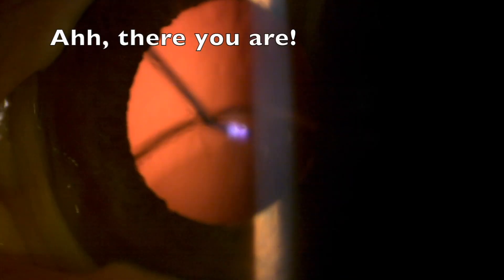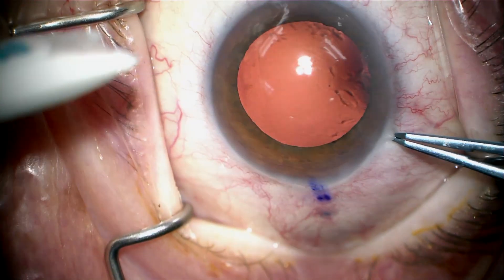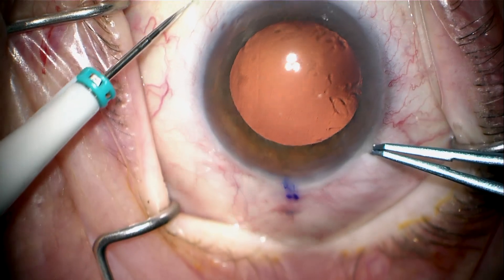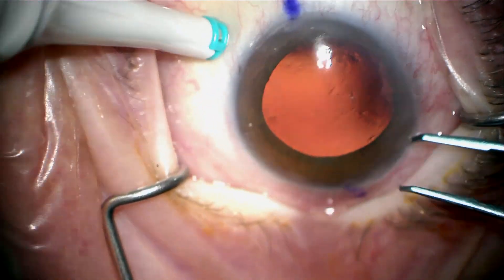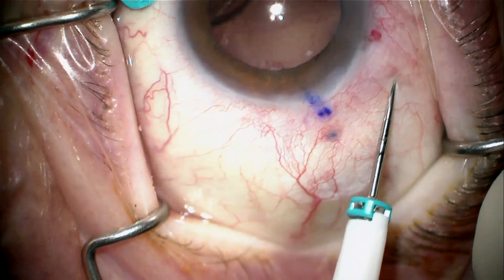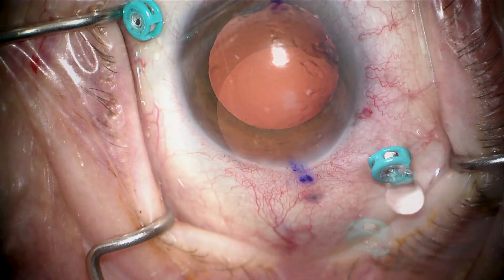This is a patient referred after endolaser treatment of a dislocated Zeiss 602 lens failed. She had the rotisserie phenomena and they tried treating the haptic-optic junction with the laser. One haptic is disinserted and the other haptic is kinked, and the lens flips in and out of view. We're going to take her back to the operating room to rectify this by taking out the old Zeiss lens and replacing it with the new AR-40 lens.